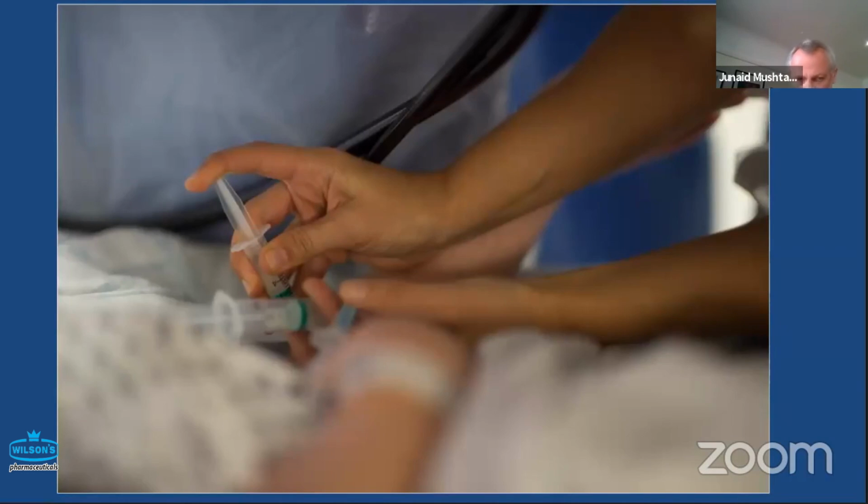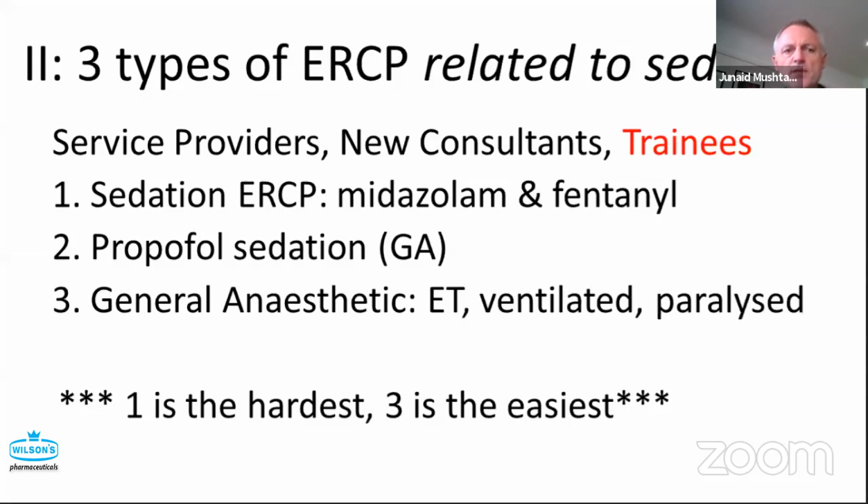A little bit of a word about sedation, and this is really directed more at our trainees. I view ERCP as broadly three types of ERCP, and they are dictated by sedation. The first and the most common in the UK is sedation ERCP in an endoscopy unit, either with a C-arm or in a dedicated radiology room. That's traditionally using midazolam and fentanyl, so an opiate and a benzodiazepine.